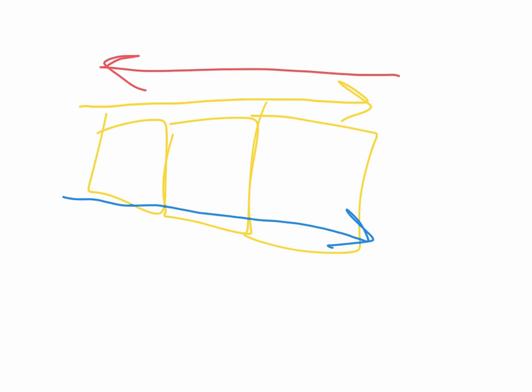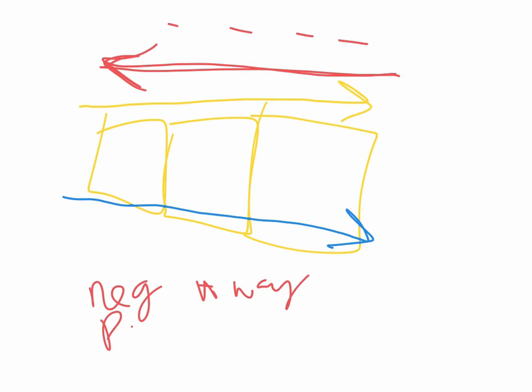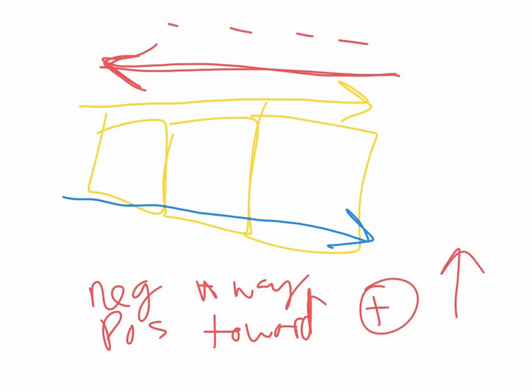That's the main idea. That's not 100% true, but the net vector of repolarization is moving in the opposite direction, and so it's going to be a negative charge moving away from a positive electrode, which is also going to cause an upward deflection. So negative charge away from, or positive charge toward, the positive electrode will cause upward deflection.